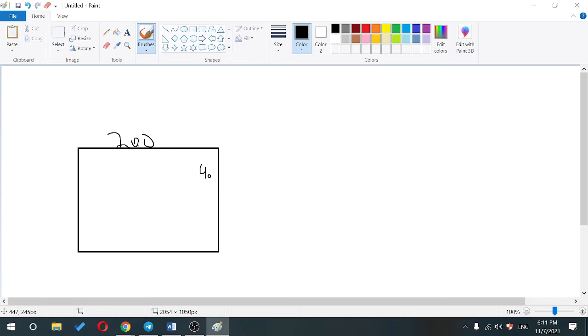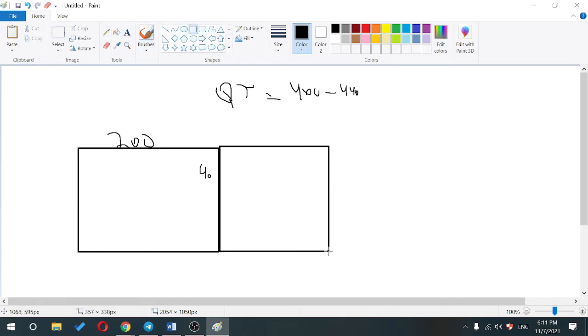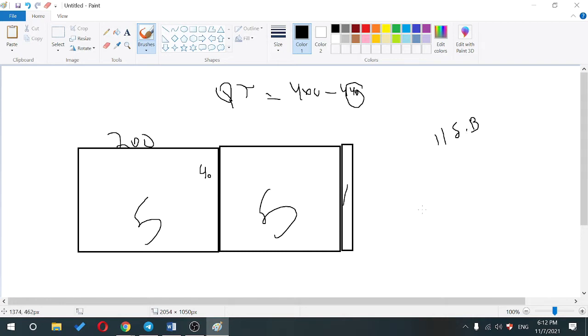Five. Yes. So I told you that the longest QT can be like 400 until 440. That is equivalent to two big boxes and a little bit. If we consider only small boxes, here is 5, and here is 5, and here is 1, because 1 is like 40. So up to 11 small boxes, it's okay. Anything more than 11 small boxes is considered QT interval prolongation that can predispose to torsades de pointes.